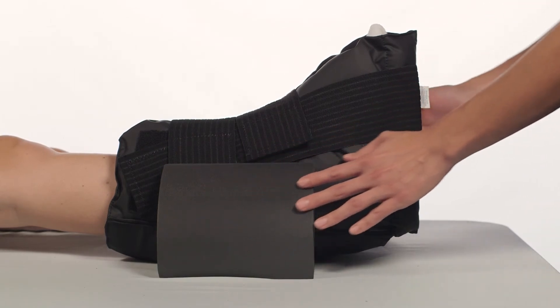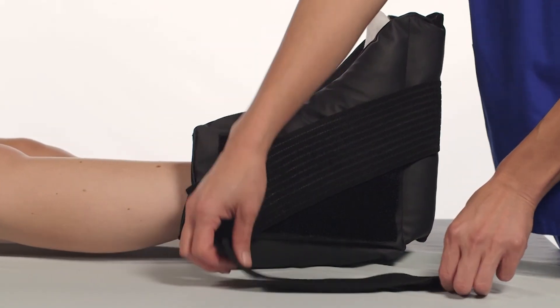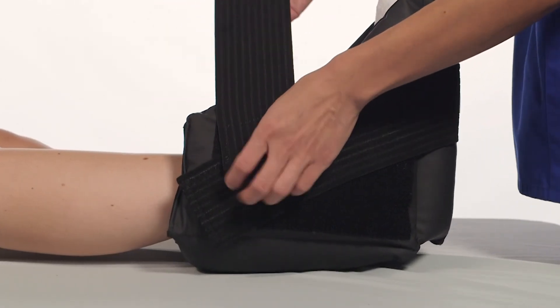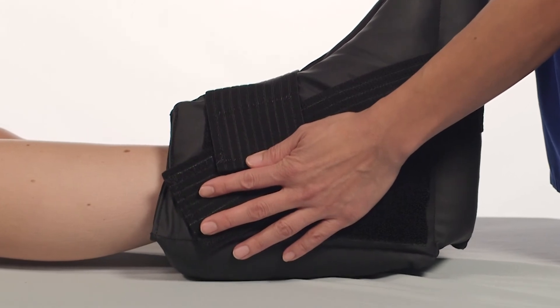If applying the Preventor short boot, use the same application instructions as the Preventor long boot; however, only use one accessory strap for a more secure application.